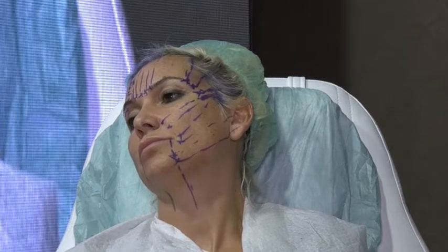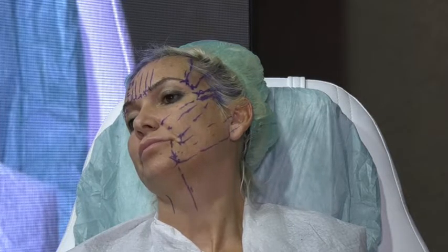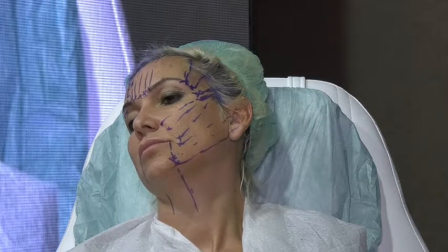Same story. You have your line. You can start from your line. How many threads do we normally need for the neck? Standard is 3. Better 4 if you have a heavy neck. If you have a male, start even with 4. So the more threads you put, the better result you will have.